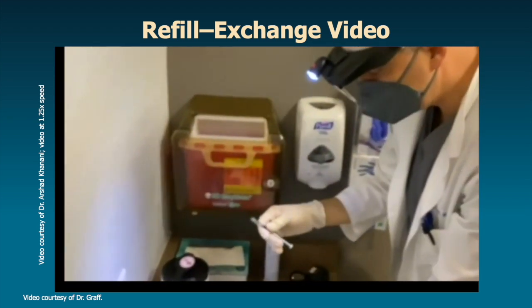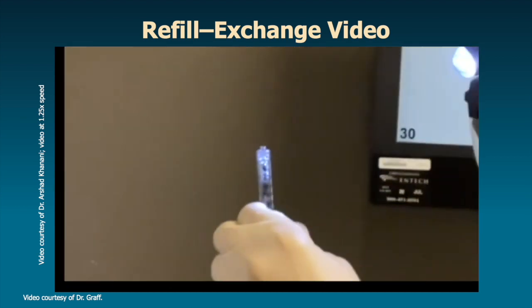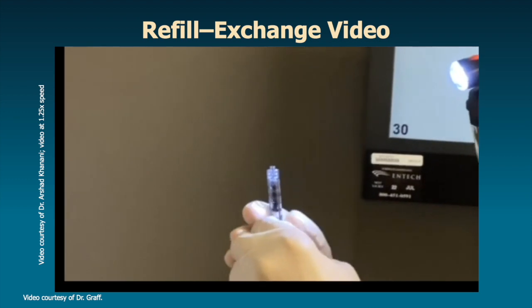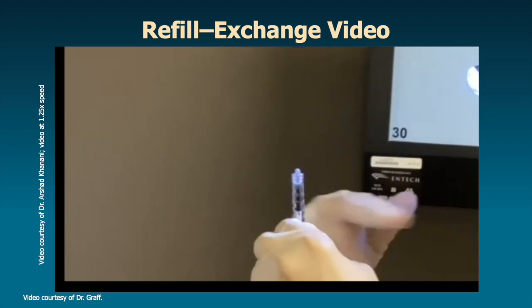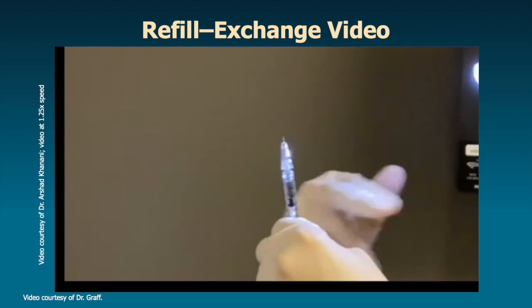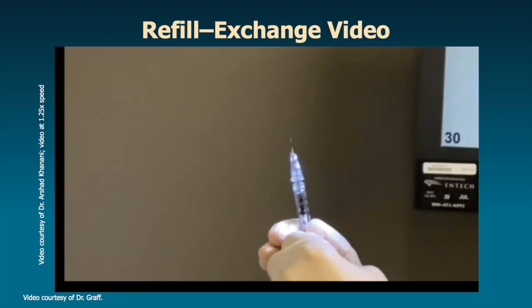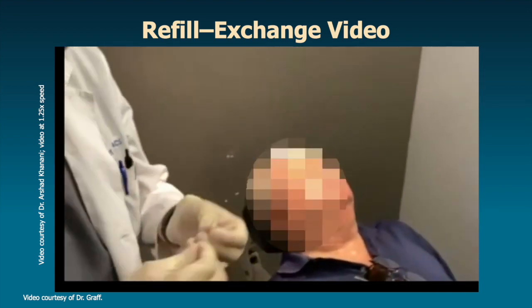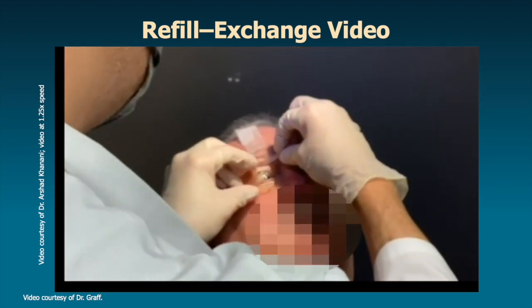Here you'll notice that the assistant is helping to hold because the vial is not sterile. When you withdraw, Peter drew attention to the bubbles both on the primary initial refill and then here on the refill exchange. We tap that out before I put on the refill exchange needle because there's a little five-micron filter that could catch some bubbles, so I try and get those out first.